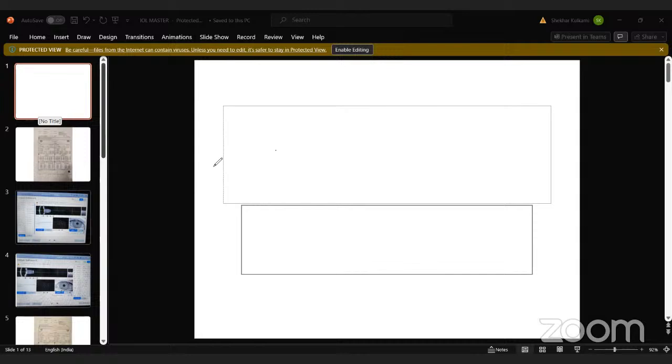So there are basic requirements. First of all, when we are going to measure an eye with an optical biometer, the eye should be untouched. Untouched means what? The patient shouldn't be wearing any contact lenses, first of all, and we shouldn't do anything that changes the corneal curvatures or axial length measurements.